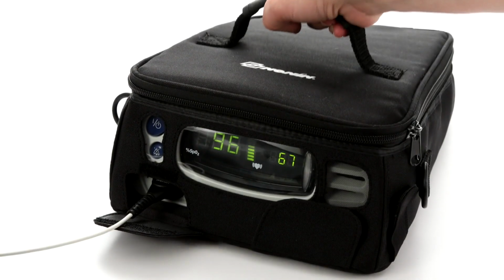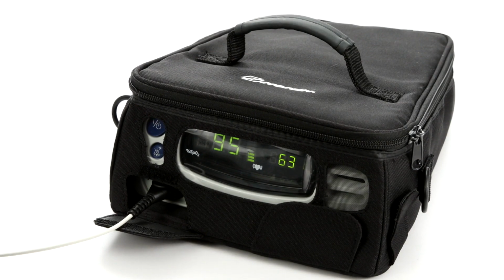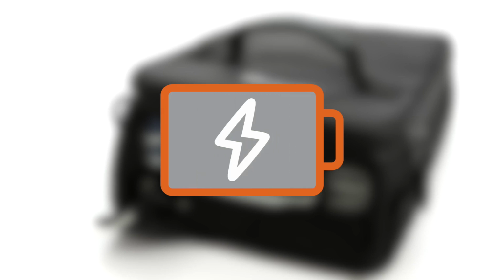The 16-hour battery life allows for the Nonin 7500 to be used as a portable oximeter when needed, for example, in transit. Additionally, the long battery life provides peace of mind in times of power outages. The low battery indicator will blink when the battery is getting low and stay on continuously when critically low. Recharge the battery as soon as possible.